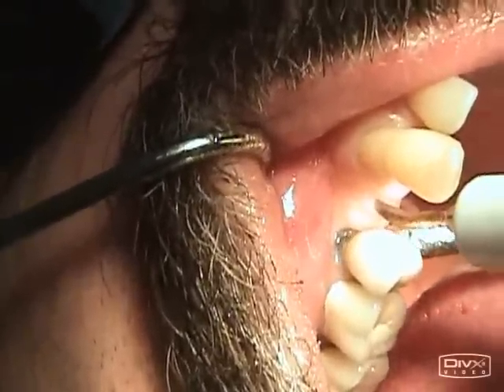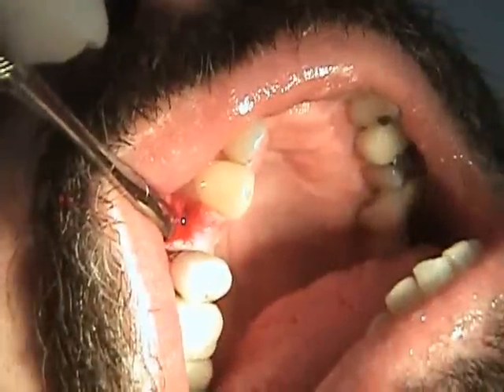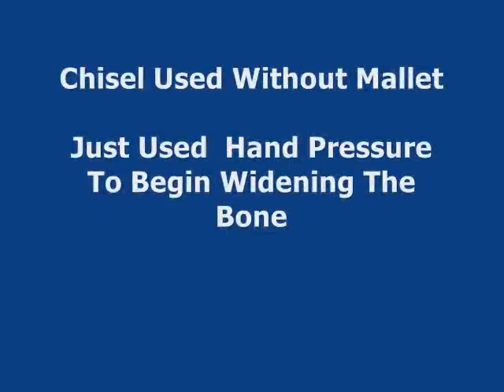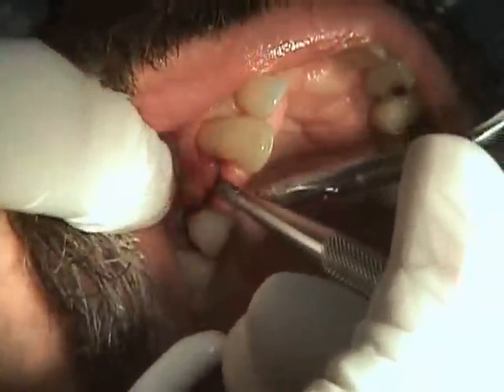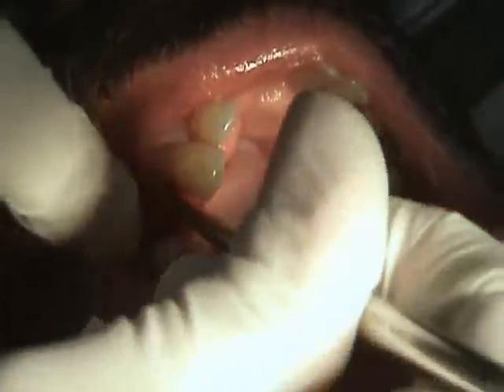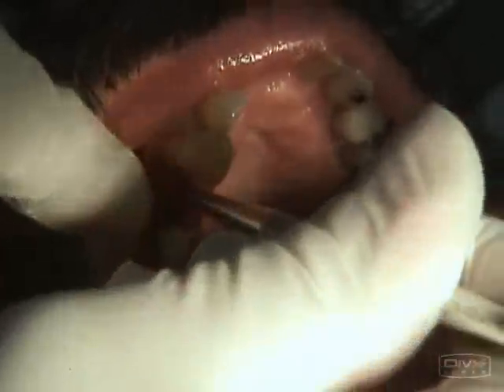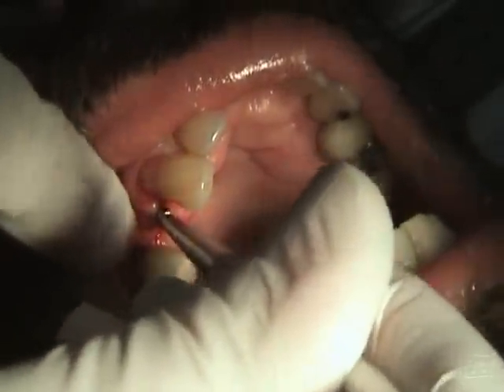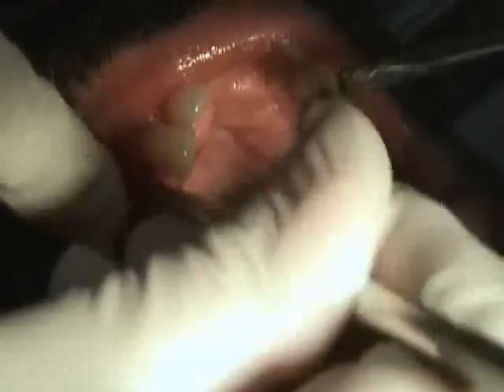The closed flap technique is used so that we can preserve the blood supply over the buccal plate. We have a little bit of a flap, and we're going to introduce a chisel — used without a mallet — into the bone flap, and begin pushing just by hand, pushing the buccal bone facially.